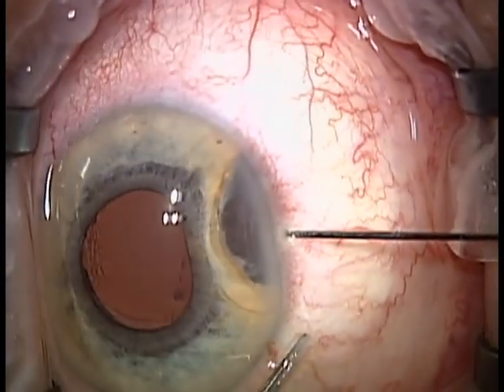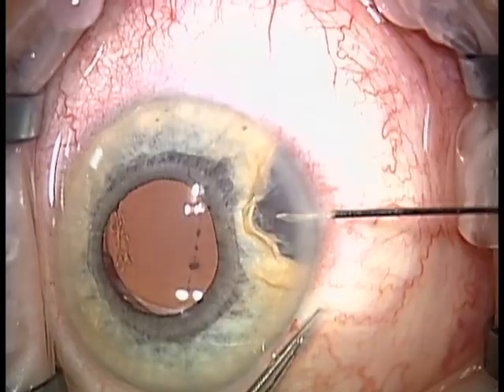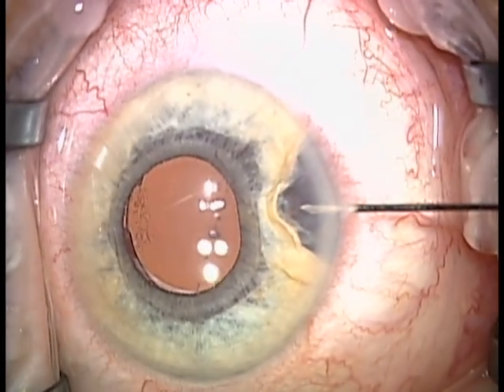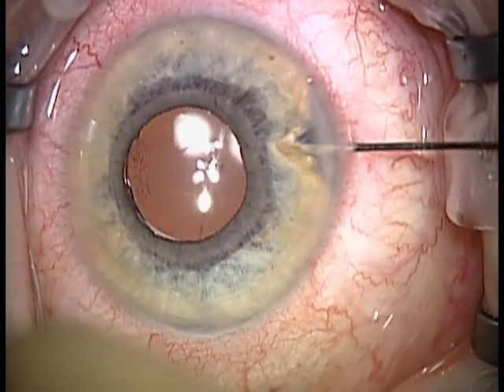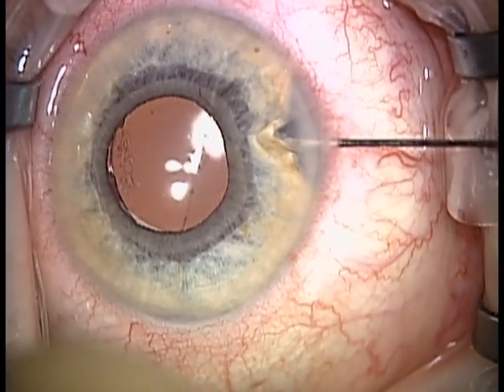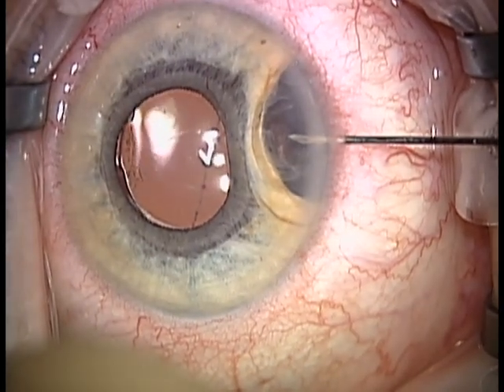The next step is to support the globe and then insert the 30-gauge needle into the interior of the cyst, being very careful not to lacerate the wall of the cyst. The cyst is then gently collapsed as far as safely possible, taking care not to lacerate the cyst wall. The cystic space is then filled with alcohol, being careful not to overfill and rupture the cyst.